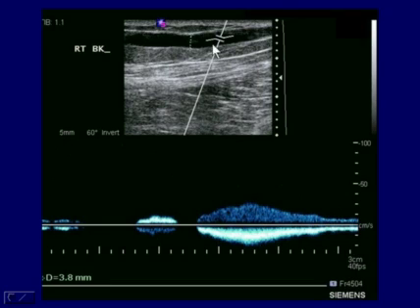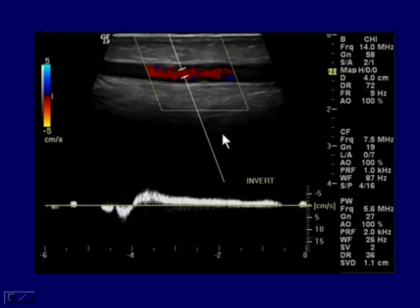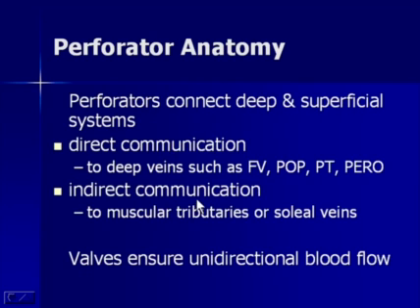Now, in many examples, I've put in the angle correct feature on the equipment, even though it's a venous study. And basically, we don't care about the absolute velocities. We care about the direction. However, this really promotes us to use a good angle. If we see it, we try to keep to 60 degrees, because if we get too far off 60, we're just going to decrease the Doppler signal so significantly that it'll make our job a lot harder. In this example here, I've turned the angle off so you can see we don't have an angle correction, but if we were getting too far off 60, we would not be able to pick up this signal as well as we are here.